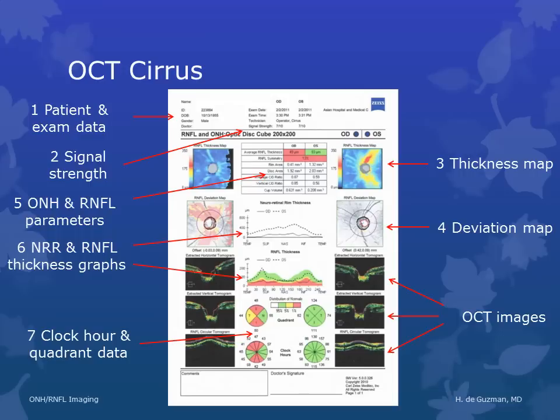This is an example of the Cirrus printout. First, look at the patient and exam data — check for correct spelling of the name and proper birth date. Check the signal strength. Then look at the thickness map and deviation map. Then the RNFL and ONH parameters, the neuroretinal rim and RNFL thickness graphs, and then the quadrant and clock hour data.